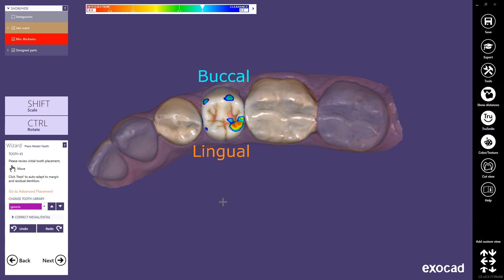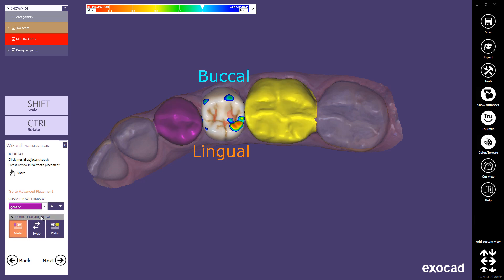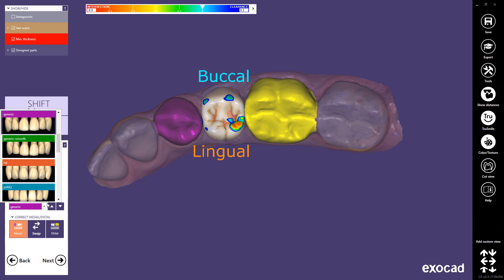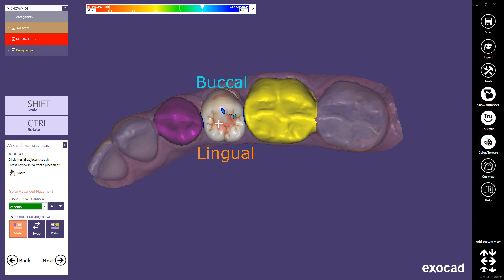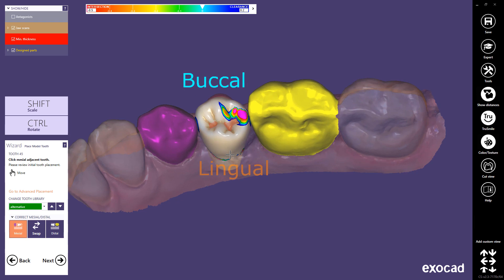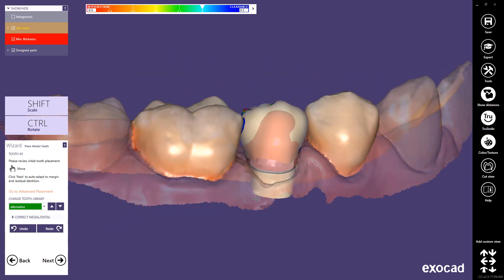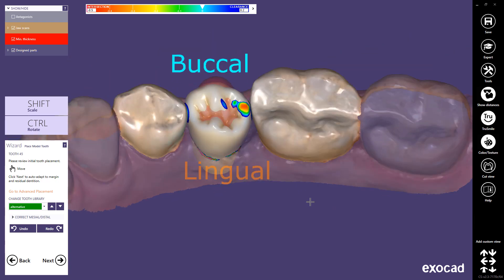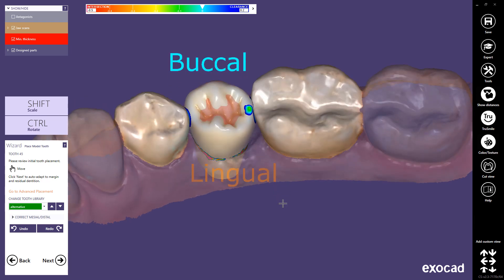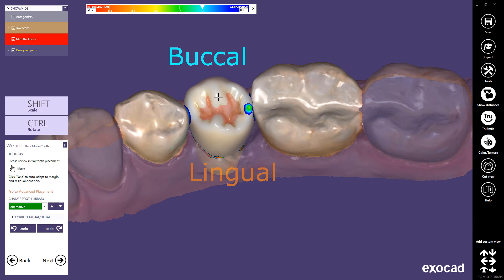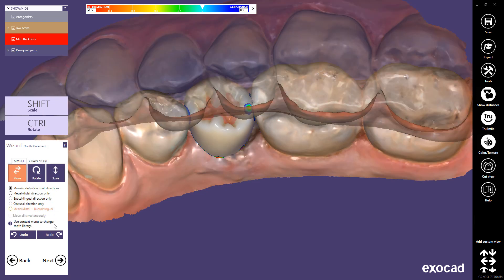The software also detects the orientation of the crown. In the unlikely event that this doesn't work correctly, you can select new mesial or distal neighbours by expanding the Correct Mesial Distal section. Using the Library drop-down, you can change the tooth library, or navigate through it using the arrow buttons. Hold CTRL while scrolling the mouse wheel to cycle between all installed tooth libraries. You can correct the suggested tooth placement by dragging the model tooth. Hold SHIFT to scale the tooth, hold CTRL to rotate it, and hold CTRL and SHIFT to perform direction-based scaling. By clicking Go to Advanced Placement, you can access more detailed tooth placement options — this will be shown in a separate video.